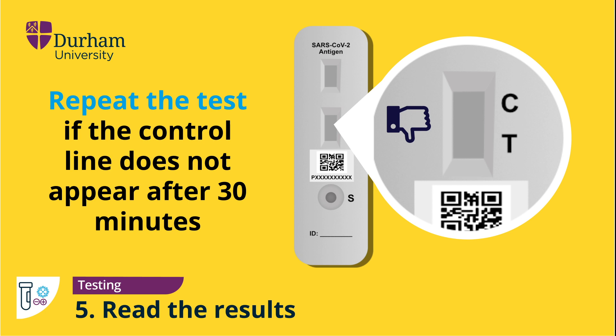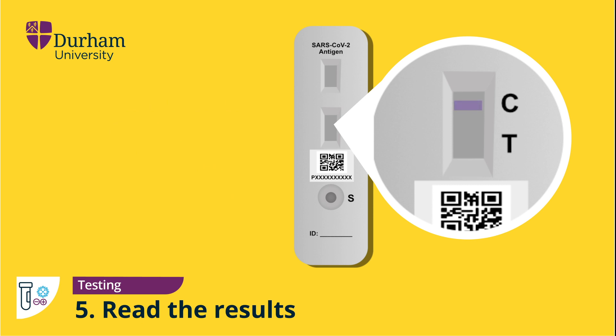To repeat the test, simply unpack another testing device and apply two further drops from the tube to the sample well, again being careful to avoid dropping any air bubbles. If the control line is present, indicating a valid test, check the result line of the testing device marked T. A line shown, even a very faint line, is indicative of a positive COVID-19 test result.